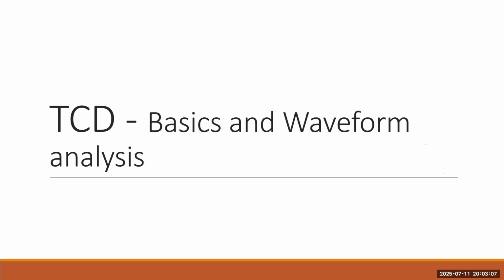Yeah, we'll just refresh some basic stuff from the last discussions, so that even if a person starts off new today, it would be useful. We have already revisited the indications of neuromonitoring, how TCD plays an important part, and how important non-invasive monitoring is in the tiered neuromonitoring algorithm, to decide on escalation, de-escalation, or intervention needed.